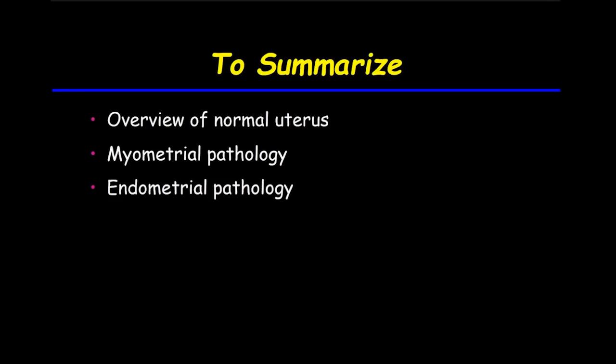So to summarize, I presented an overview of ultrasound of the uterus with occasional correlative imaging, both the normal appearance and pathology of both endometrium and myometrium.